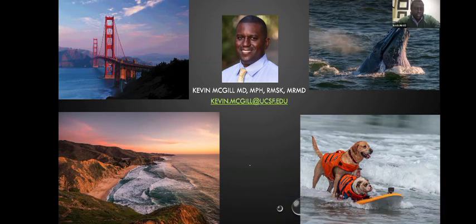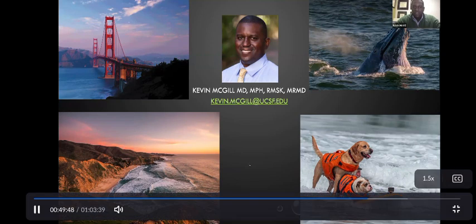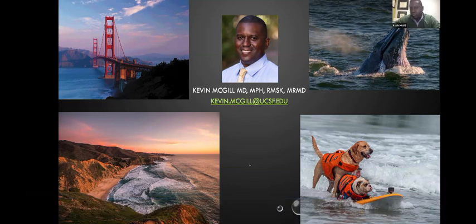So, do we routinely do 3D formatting? We don't do it routinely. I think it's something that we can do, but I'm more of a strong believer in ultrasound. Ideally, we should be able to make the diagnosis on MRI, because it's not just what the image is, it's going along with the physical exam findings, the history, and the type of injury. Once you put all that together, MRI is going to be pretty good the vast majority of the time. And when there's concern, I prefer to have the ultrasound. It's difficult to preemptively know which people would need the fancy MRI, and that's why it's difficult to use it routinely.